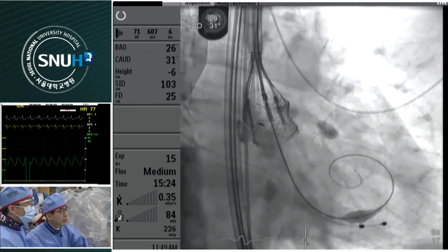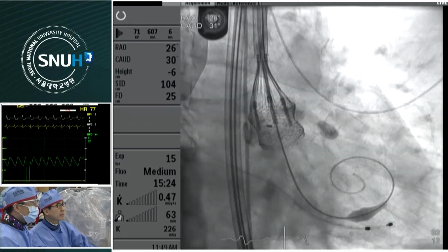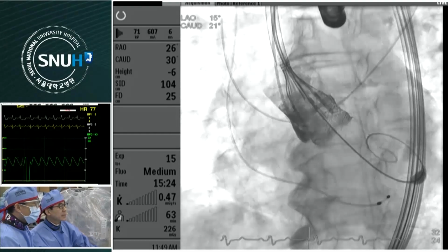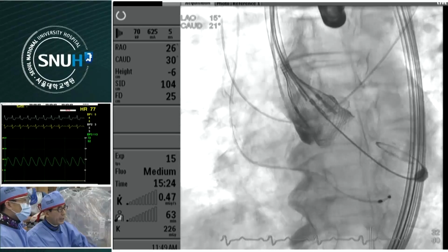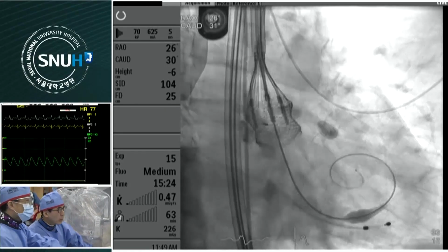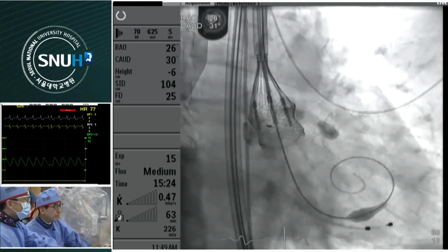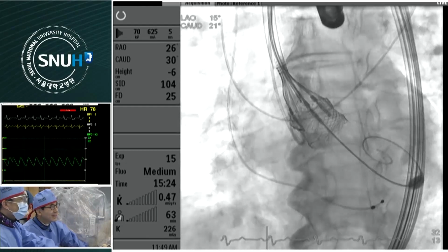Which one? Left one? Okay, good. Minus. This is the previous Cine. Two rights are okay. Next, plus. Left one is also okay. I'm not sure about the previous angle. Can you rotate it a little more?